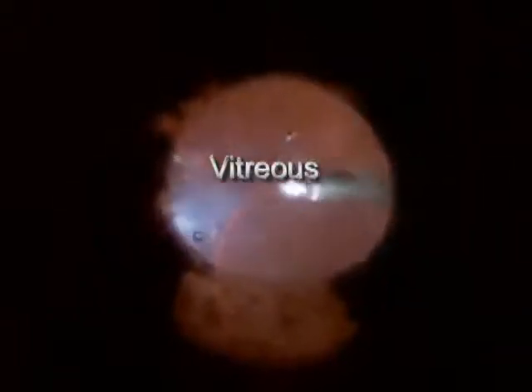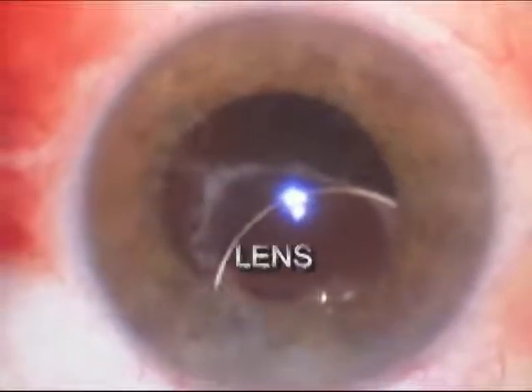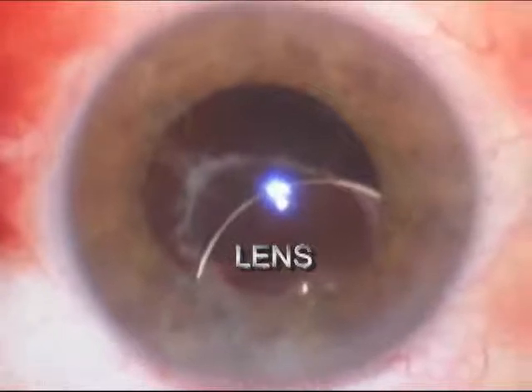What you're seeing here is the cloudy vitreous being removed from the eye prior to removing the epiretinal membrane. The instrument on the right is a small vitrectomy cutter. There's a light pipe on the left side of the screen which is used to illuminate the eye. We use a special lens system to visualize the back of the eye, and what you're seeing here is the vitrectomy being done in front of the retina. The orange background is the retina. You can see the edge of the intraocular lens about the middle of the screen, and the intraocular lens is de-centered.